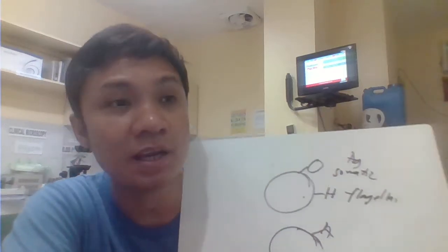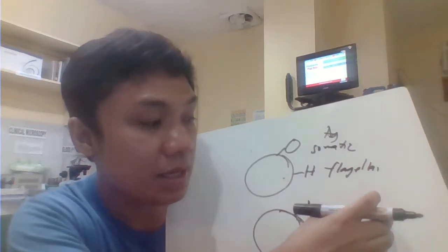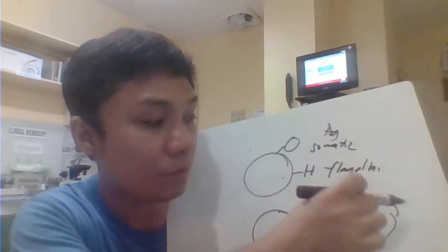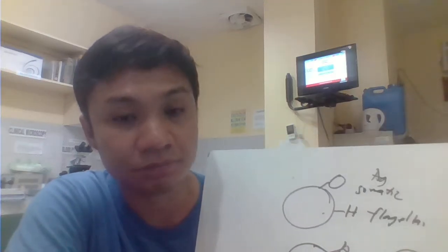We do not use a carrier particle to detect this. It means your agent here is just a reagent, the anti-sera. It has no carrier particles, because it can already detect this even without carrier particles.